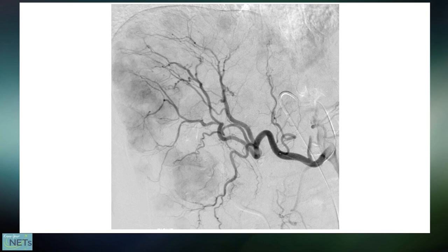And then this is what it looks like on the angiogram. And you can see here in this liver, there's a bunch of those big round spheres, and those are all tumors. And it doesn't matter how many tumors you have, because we can put the catheter as close to the branches that feed all of them and then inject the radiation.